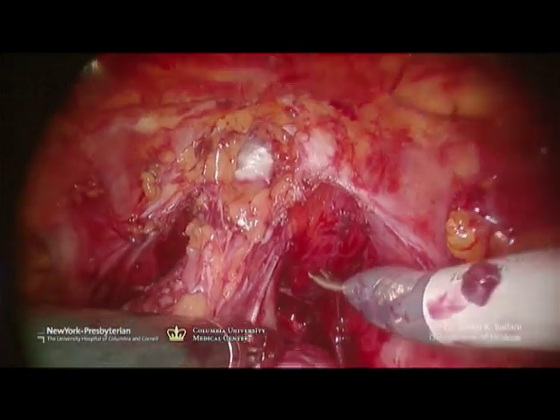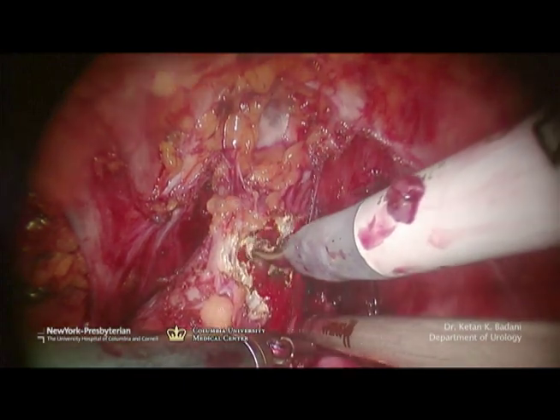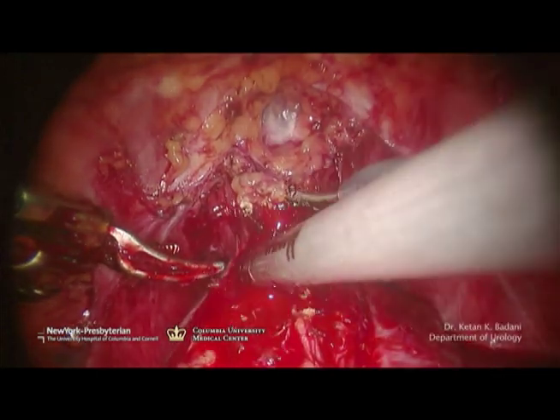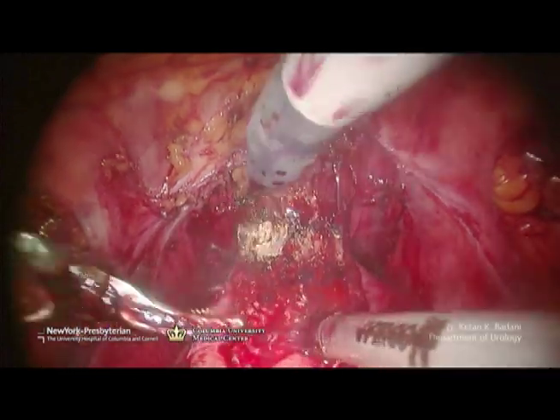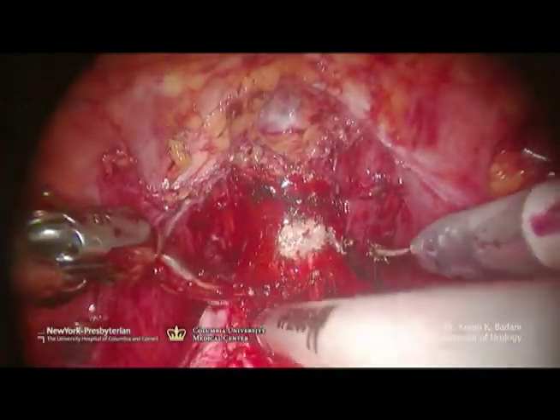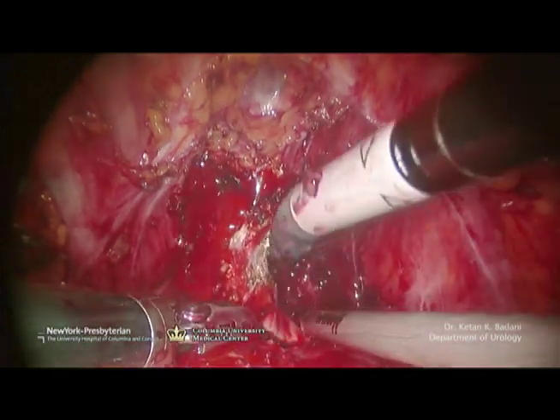Transection of the dorsal vein. Identification is made of the dorsal vein and the urethra, and a healthy margin of tissue is left at the apex. The stitch was not placed before transection of the dorsal vein. In many instances, I do this because my area of incision is sometimes hindered by the stitch placement, so I will transect the dorsal vein first and then over-sew it after. The pneumoperitoneum can be made higher during this part of the operation to allow adequate hemostatic visualization. You do have to tolerate slightly more blood loss — when we studied this, on average there was 35 cc's more blood loss.